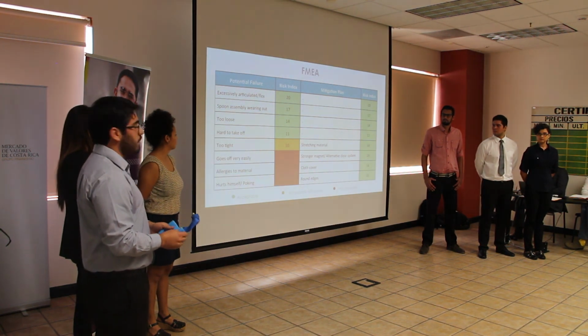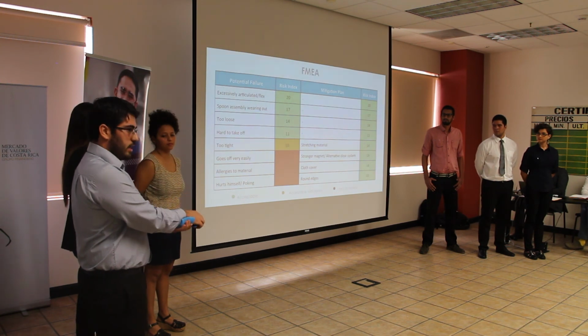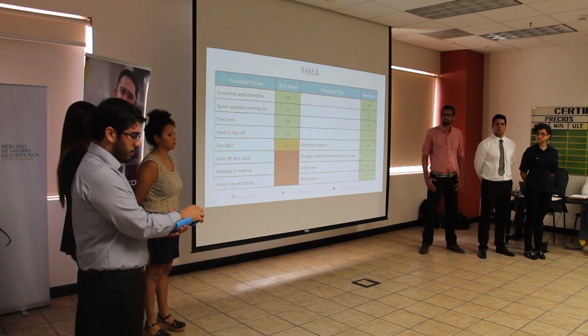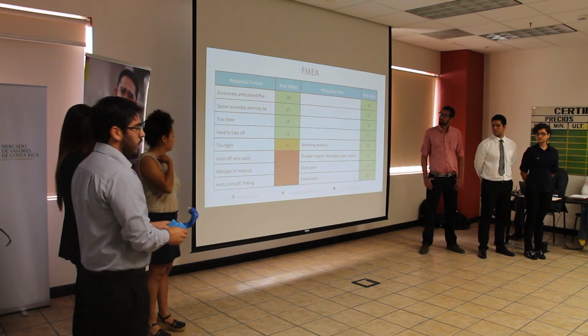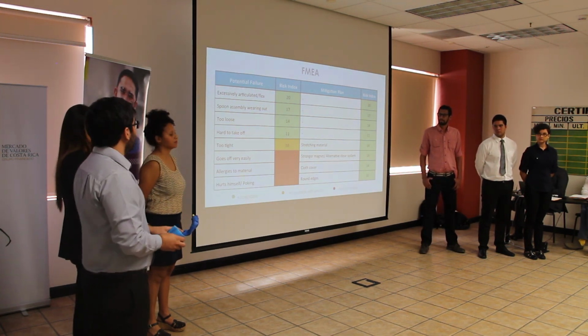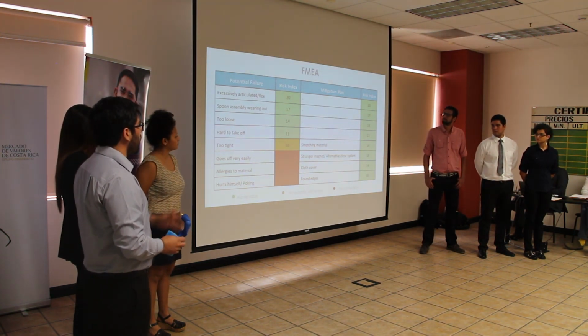Our mitigation plan consists of using a stretching material to control the risk of adjustment, and a stronger alternative closure system to control the same thing. A cloth cover for those who are allergic to our product, and round edges to prevent them from poking themselves and getting hurt. As you can see, the end risk index is all acceptable.